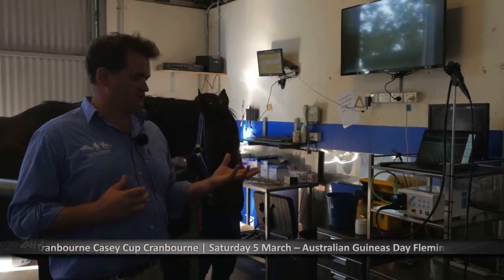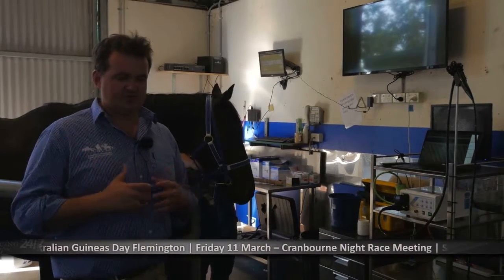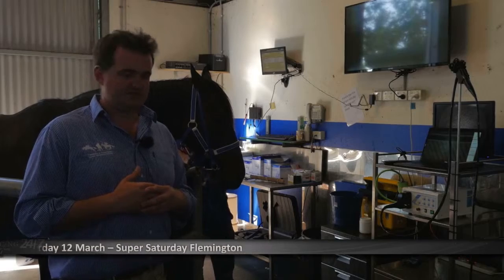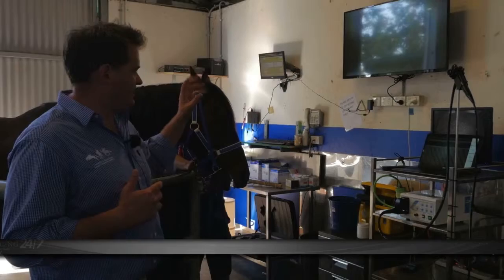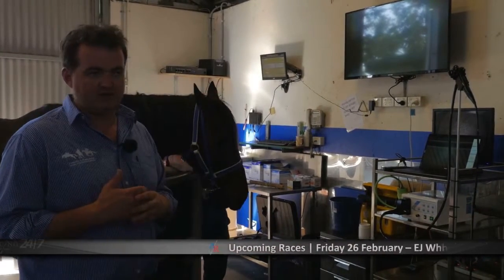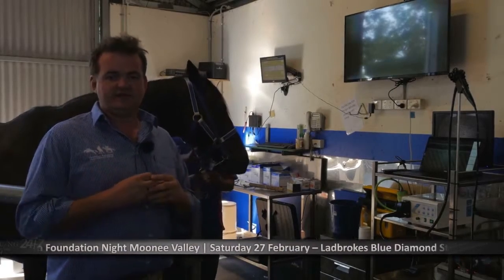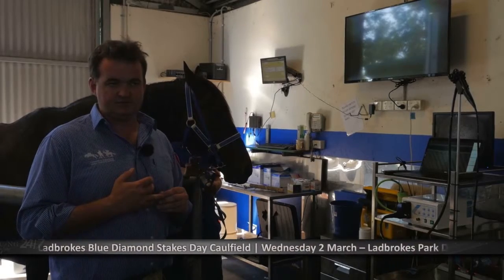We also record all the scopes to monitor the function of the throat. We know racehorses can be prone to certain conditions of the throat that will affect performance. We record them, we store them over time, we can then look back over history. The other thing we have also is up on the wall we have our link to our veterinary database, so every horse that we've looked at, we can look at their full clinical history. And that's really important when we've got stables in Ballarat, Spelling Farm and Stonehenge Farm, and it's important to keep on top of what's previously been done to the horse so that we can follow up if there's any issues.